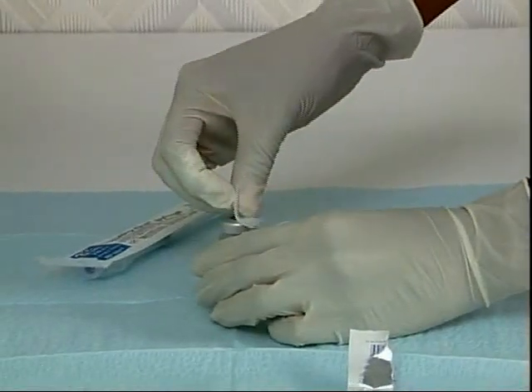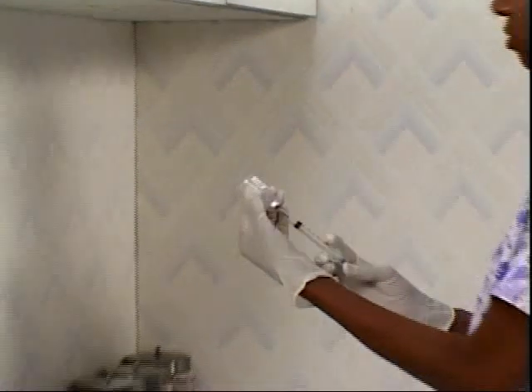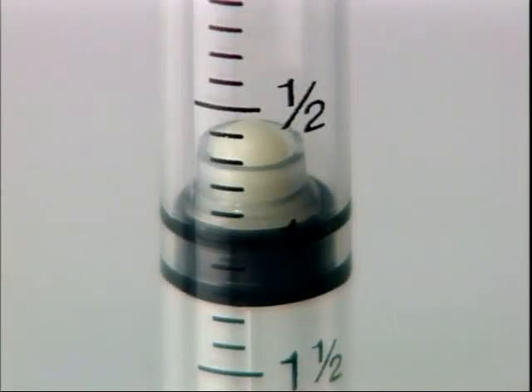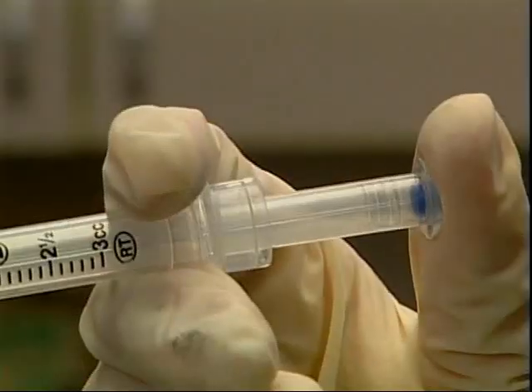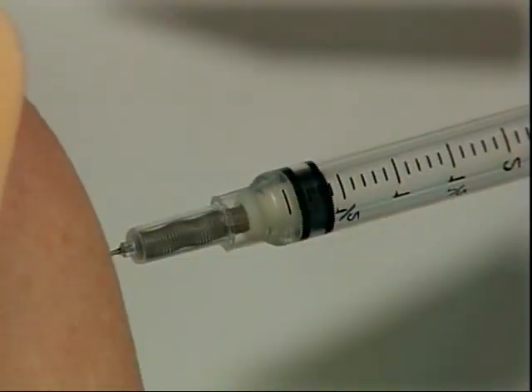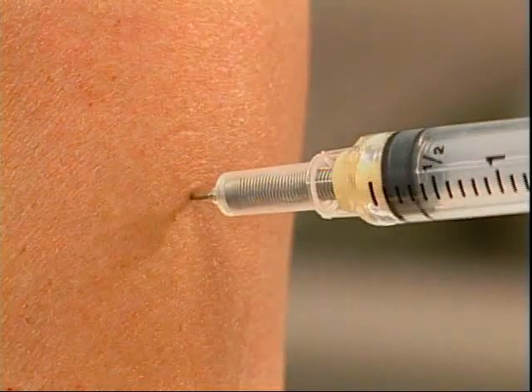Draw up medication as you normally would. You may inject air into a vial if necessary. Measure the medication dose using the leading edge of the black plunger seal. The retraction mechanism on top of the plunger seal will not interfere with measurement and has been accounted for in the calibrations. When injecting, fully depress the plunger to give the complete dose and activate the retraction mechanism. Using your thumb to depress the plunger and positioning your fingers under the flanges will allow you to easily squeeze through the slight resistance point.